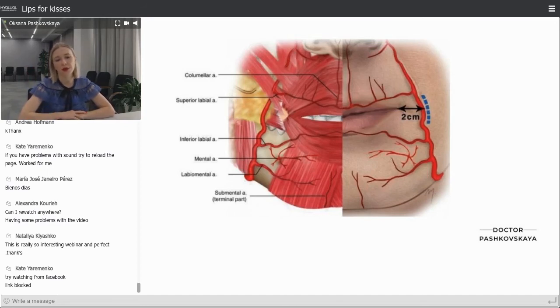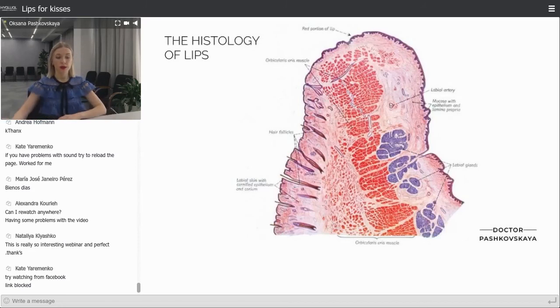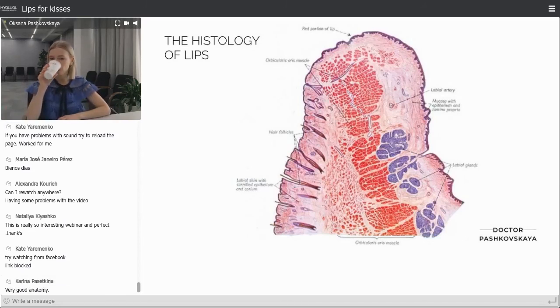Of course, there are individual features and some distinguishing signs with vessels, but we could take a ring in our minds, and that zone is the most dangerous. So you could also make a screenshot and we will move on.